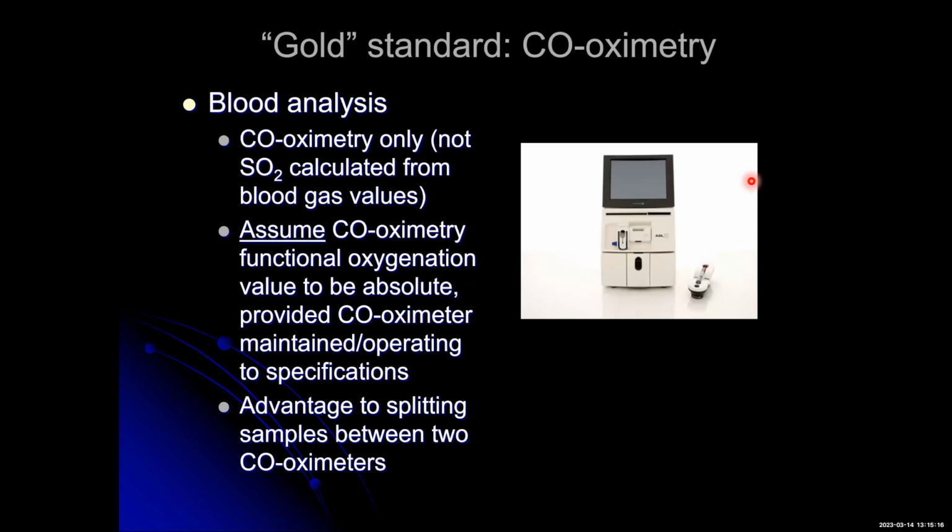You can be that far off between clinical practice, and I'm not saying it's uncareful or random type of clinical practice. These are situations that are real clinicians collecting blood in a stable infant and putting it in a careful way in the analyzer.